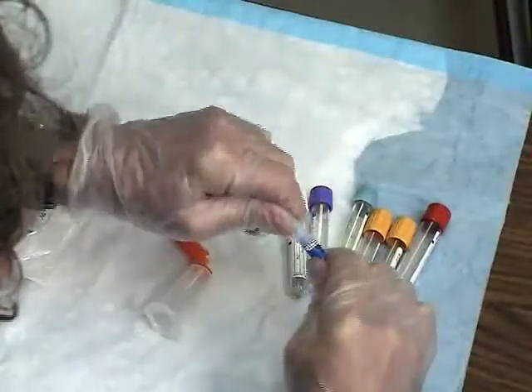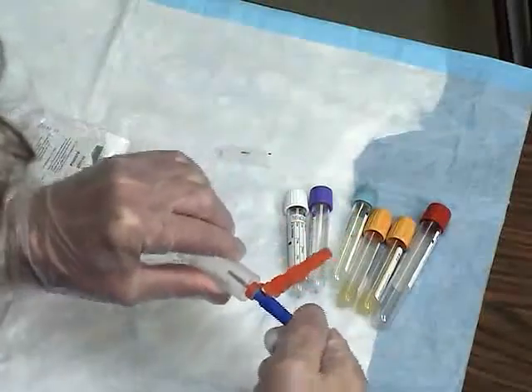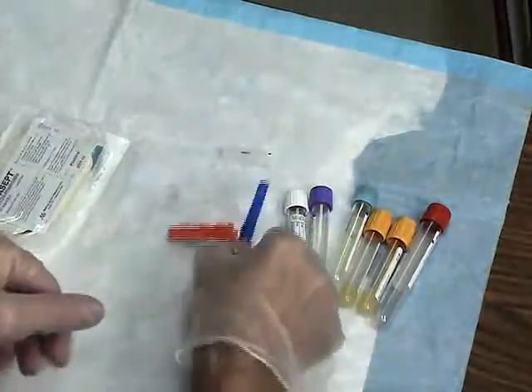If phlebotomy is to be performed during the cannulation, attach the appropriate adapter to the vacutainer holder and collect the required specimen tubes.